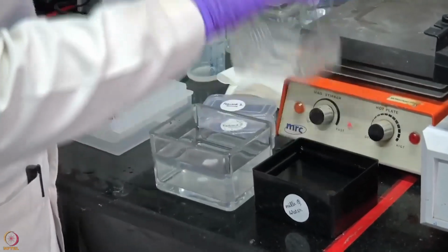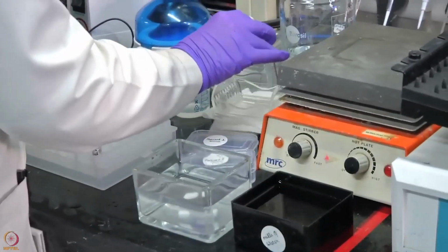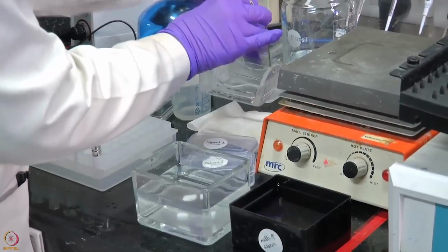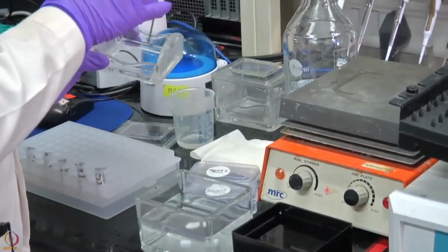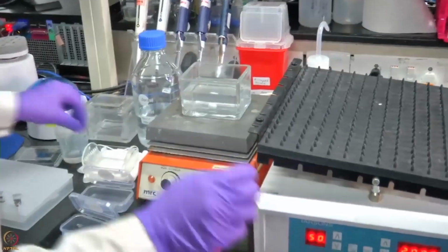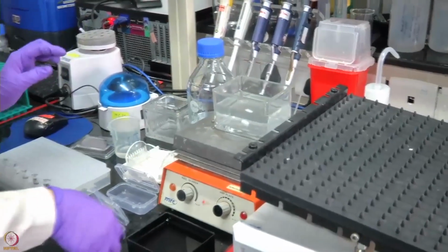The slide is then spun down to dry and to remove all the extra buffer. So we remove the water by placing the cassette on the tissue, and then we spin it at 900 rpm for 2 minutes. Once the slide is dried, we place the slide back into the boxes.